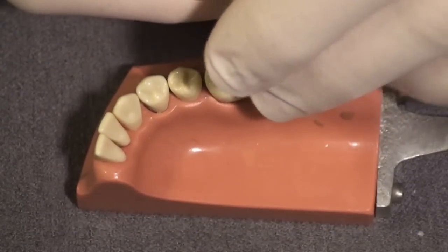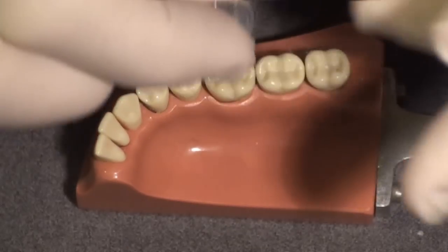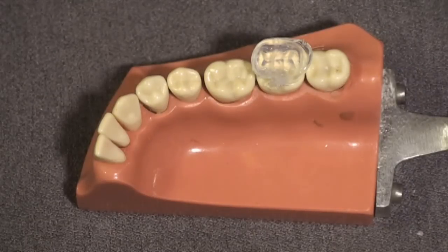This little matrix has a tremendous amount of surface detail information trapped in its surface. It's going to be used as a die to reform the unset composite before I cure it, and then I will cure through it, curing in the original anatomy, surface texture, and occlusion that the patient was comfortable with when they walked into the operatory.